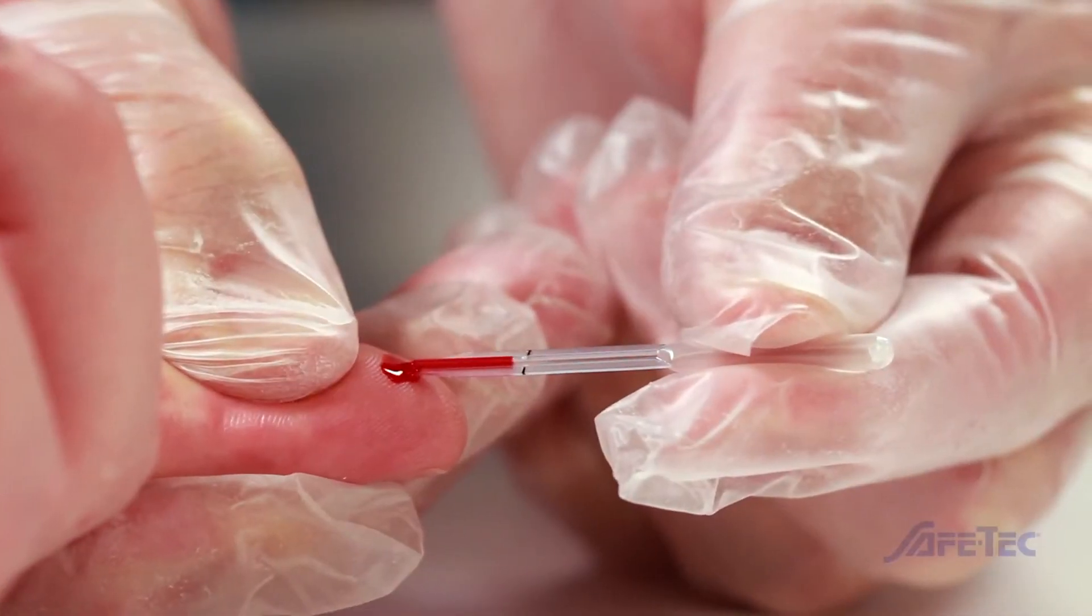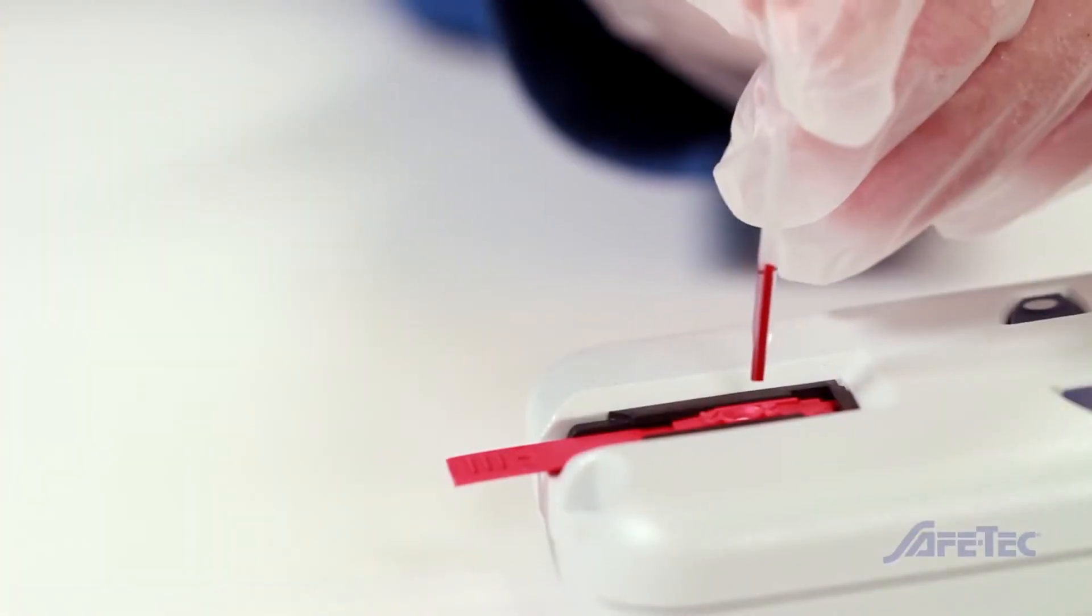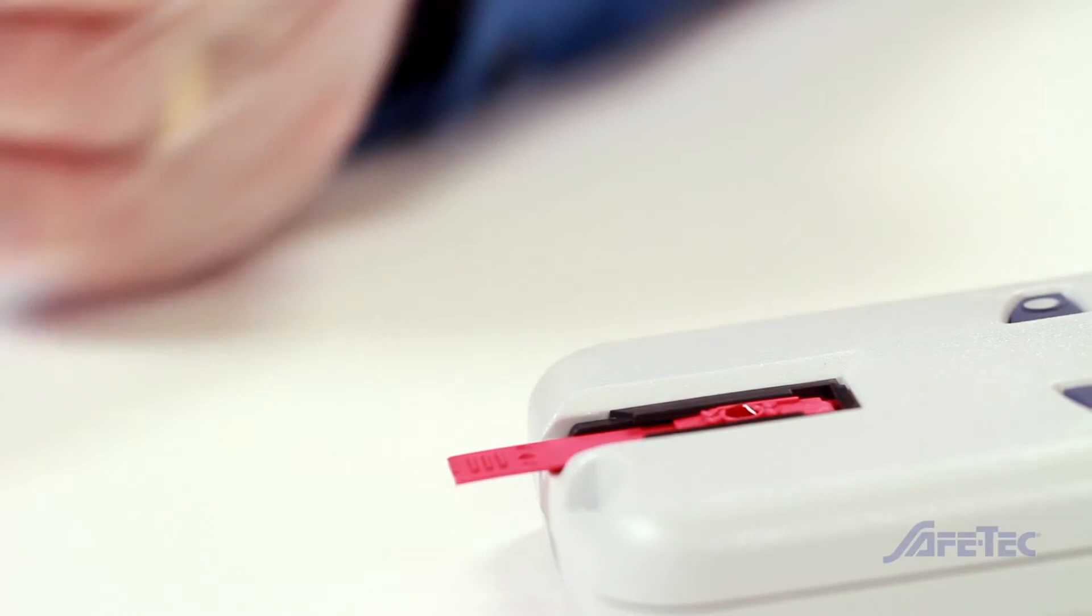Microsafe fills automatically by capillary action while the air vent regulates the preset volume. Expel the sample by squeezing the unfilled portion of the tube and then discard.